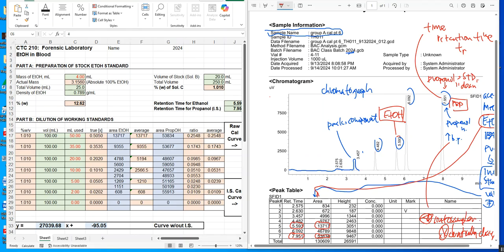So we're going to have to figure out what numbers are going to be dumped into the spreadsheet. And the spreadsheet is what you're seeing over on the left-hand side. Yours might be a little bit prettier. It might be reorganized slightly, but all of the important information is going to be there. It just might be in a different location, or visually it just might look different. So don't freak out if it does. And we need to figure out how I input the data.